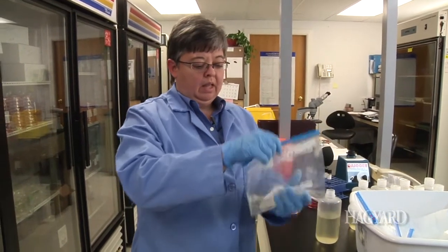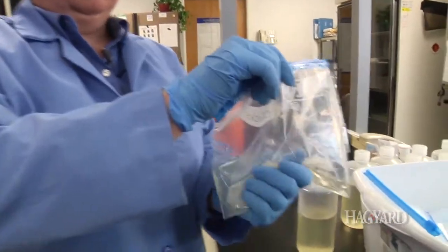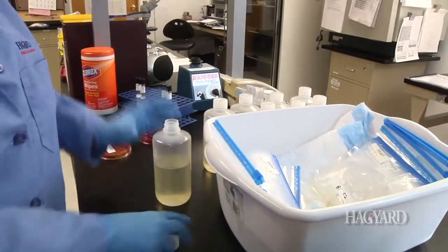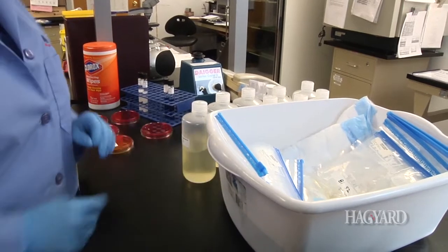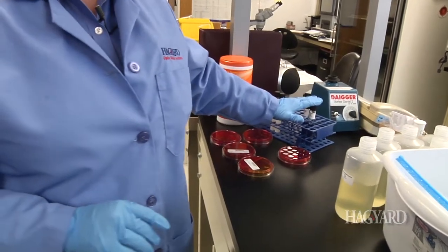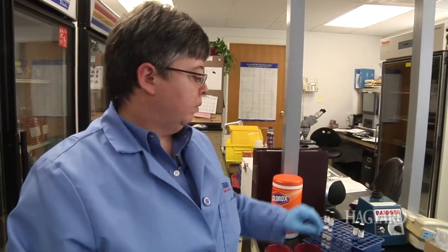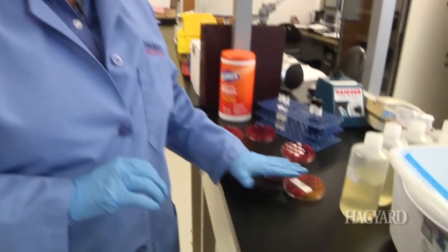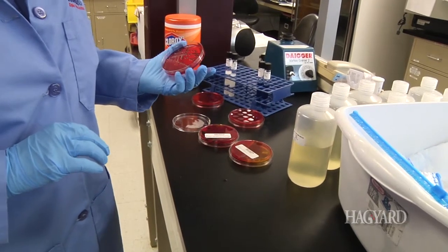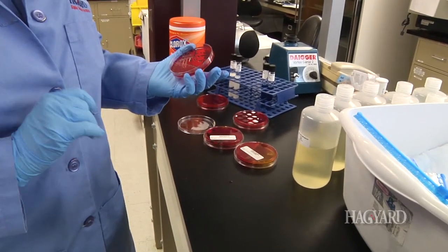And that's the enrichment broth you're putting in right now, right? Once we have it labeled, we will add the enrichment broth, and after it's in the enrichment broth, we incubate it overnight, and then we will transfer some of the specimen to our selective broths for salmonella, which enhance the growth of salmonella and inhibit the growth of other organisms. After incubation of the broths, we will then transfer some of the samples to our selective plates for salmonella, which also enhance the growth of salmonella and inhibit the growth of other organisms. And it also helps differentiate salmonella from other organisms.